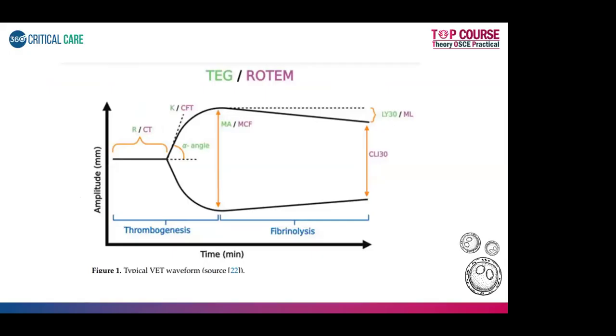Okay, so this might be a typical normal viscoelastic graph. Okay, so usually you'll have a lot of nomenclatures that you need to remember. Okay, so you have time in the x-axis and amplitude on the y-axis. So the first half of the graph is called the thrombogenetic pathway, and then you have the fibrinolytic pathway. Okay, so whatever is in purple here is the ROTEM parameters, and whatever is in green is the TEG parameters.